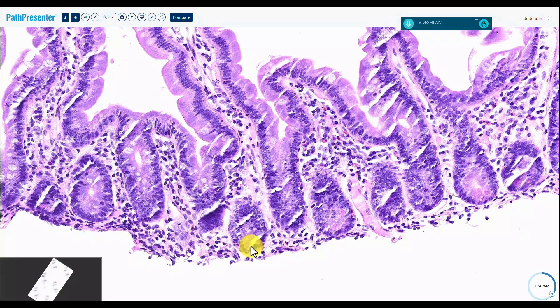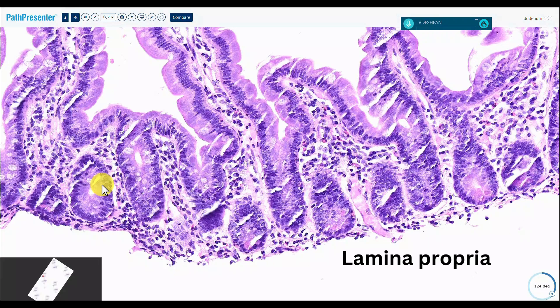These are Paneth cells. Between Paneth cells lie stem cells, which you can't really see. As they mature out, you start seeing absorptive cells and goblet cells. You can't see endocrine cells on H&E, but believe me, they are there.